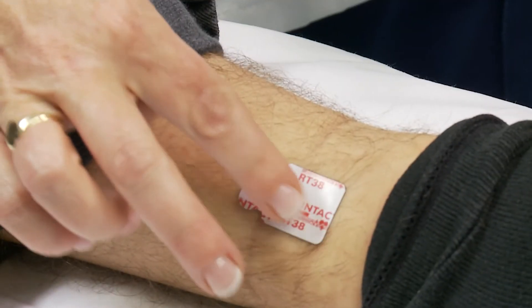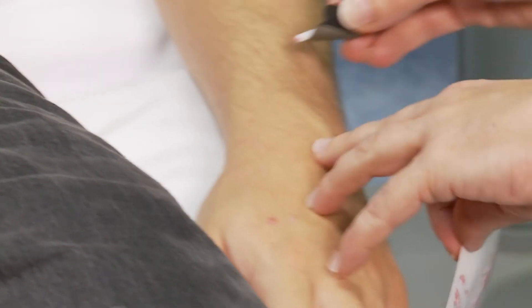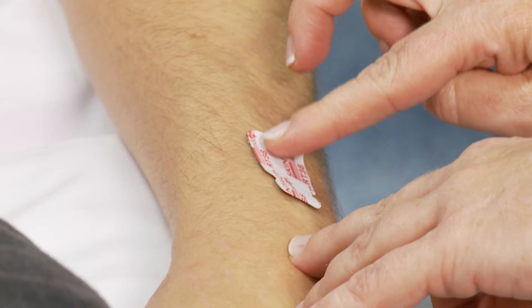The electrodes are located one on each of the limbs as follows. On the lower limbs, attach an electrode proximal to each ankle. On the upper limbs, attach an electrode proximal to each wrist.